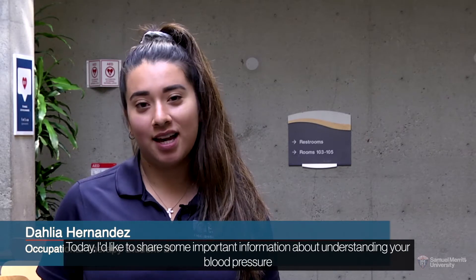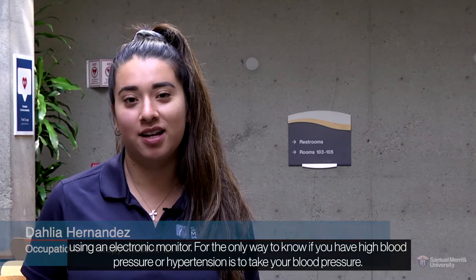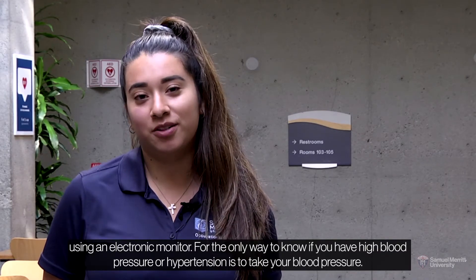Hello, my name is Delia and I am an Occupational Therapy student at Samuel Merritt University. Today, I'd like to share some important information about understanding your blood pressure reading and learning how to take your blood pressure at home using an electronic monitor, where the only way to know if you have high blood pressure or hypertension is to take your blood pressure.